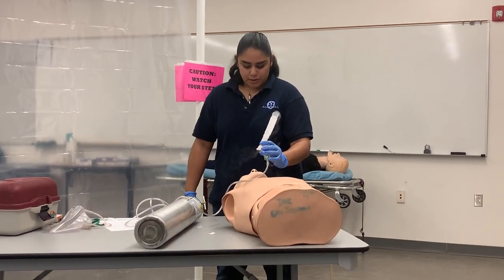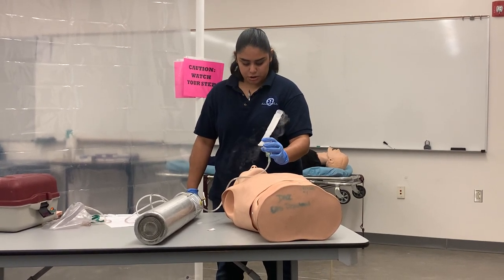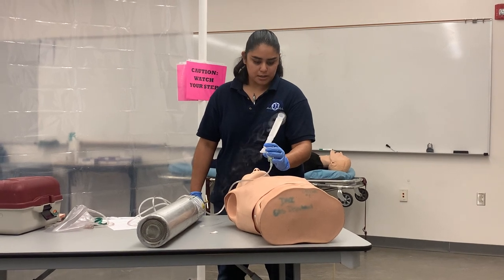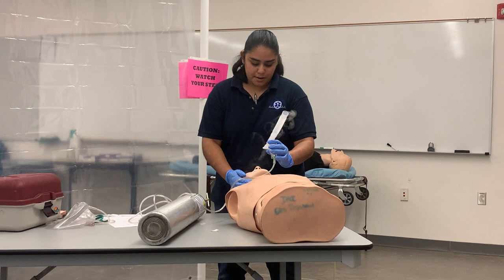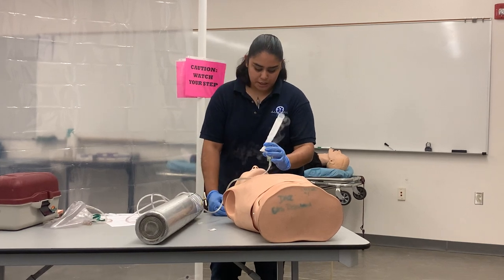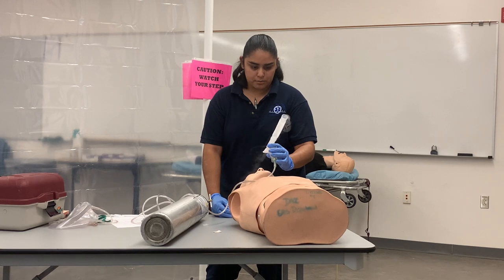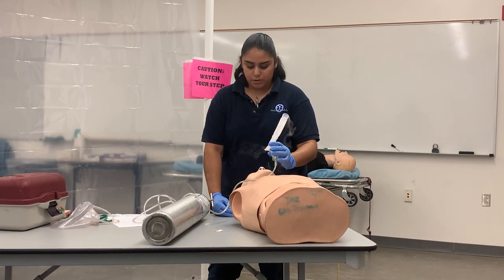I'm looking for desired effects or adverse effects. My desired effect is that my patient should be having an easier time breathing. I'm going to use lung sounds to make sure they're starting to clear up. Then I'm going to document what time I gave this medication, making sure I have the right drug, the right patient, and the route, which is inhalation.